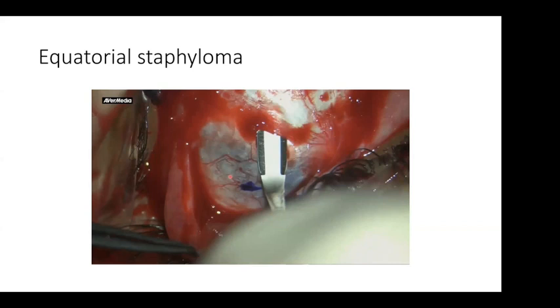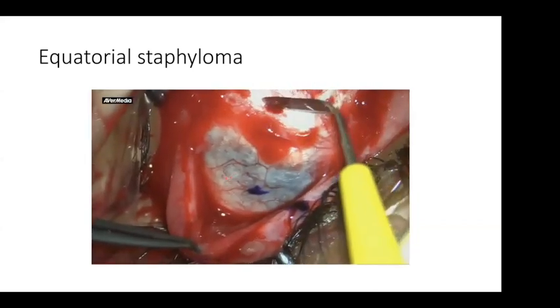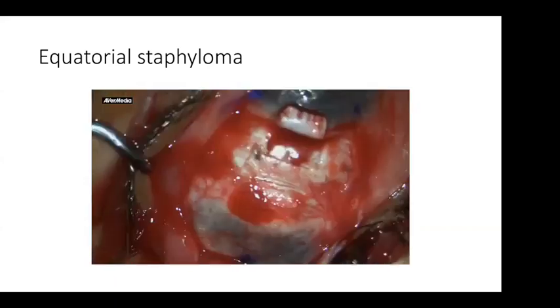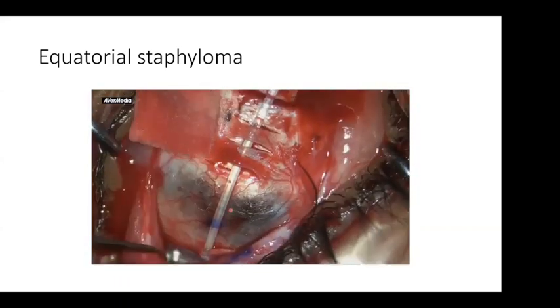We could have this picture after a buckle, for example, but the patient was not buckled. So I decided to make the pockets in front and behind this area, and then to make the tube just crossing in front of it. And I was satisfied with this management.